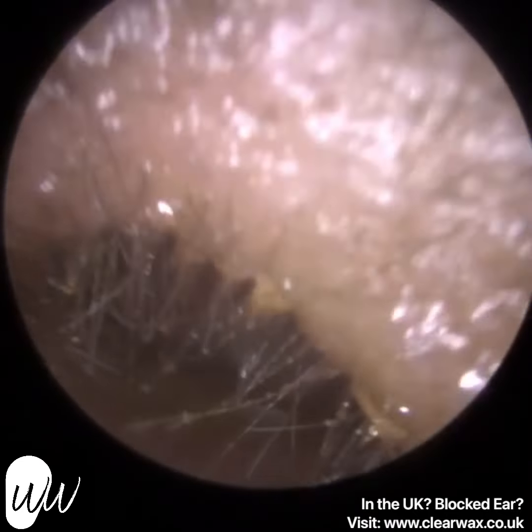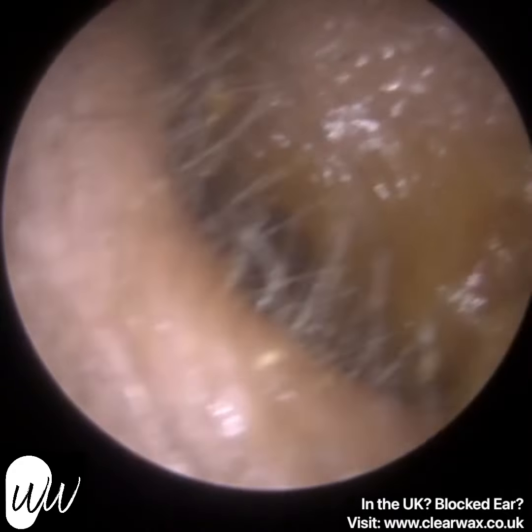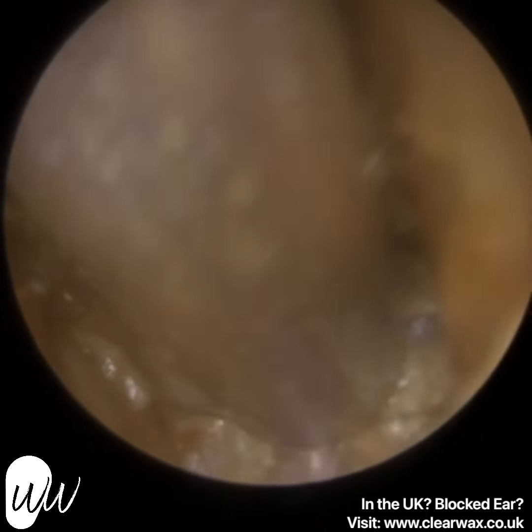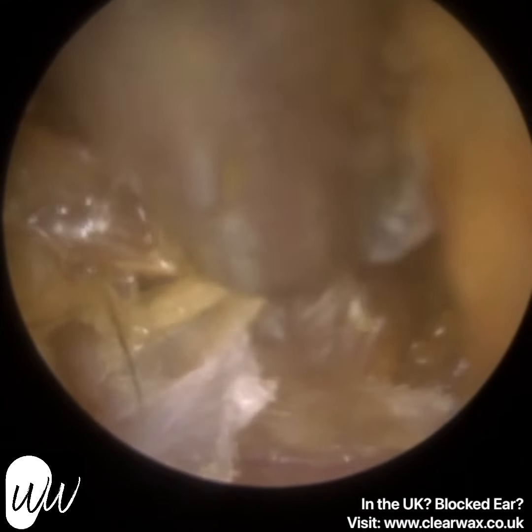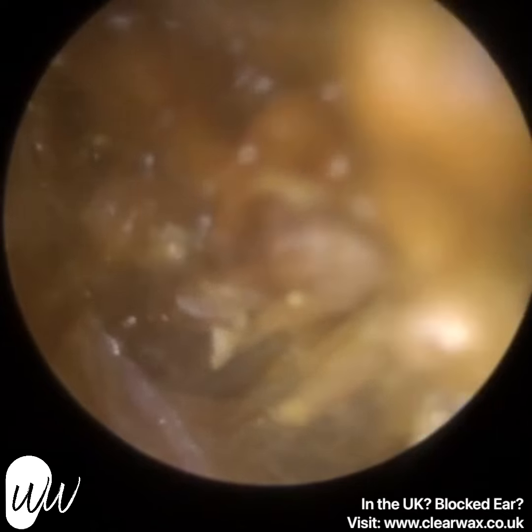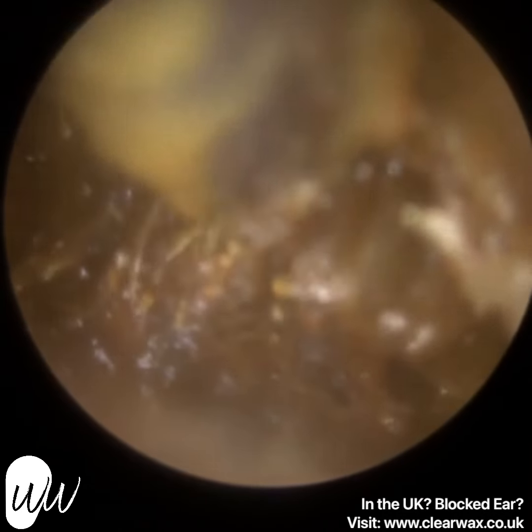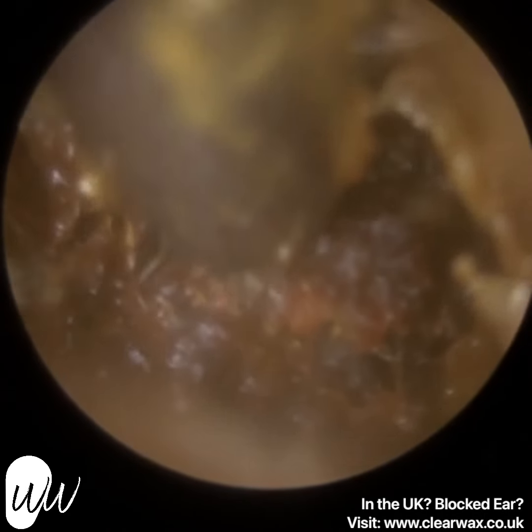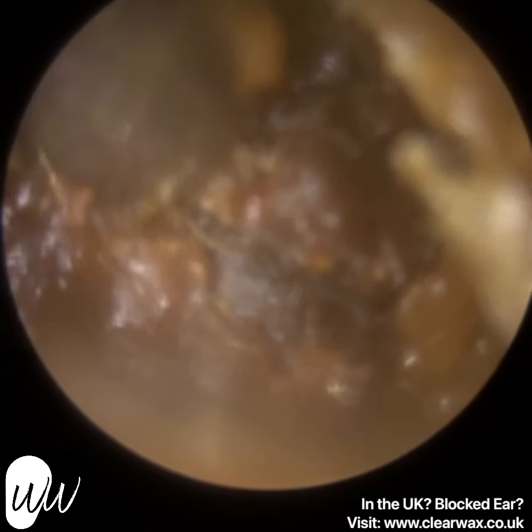So I managed to extract this medial wax, and the eardrum's nice and healthy. This is the patient's right ear, where they put more hydrogen peroxide drops. You can see it's a lot more mushy, a lot more stodgy. It's more like a swamp in there. I'm just trying to think of the best way to describe it. It's just very wet and sticky and stodgy, with a lot more skin on this side, a lot more keratin. So those bits I removed there were actually dead skin. You can tell by the appearance it slightly had a ribbon effect.